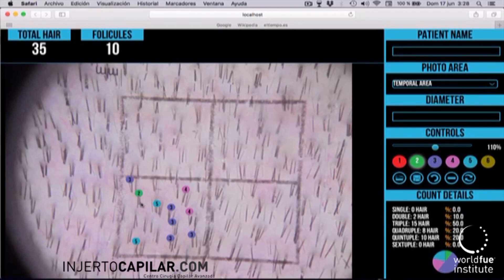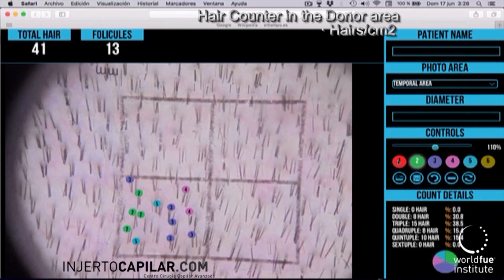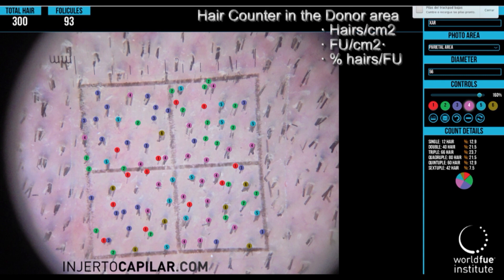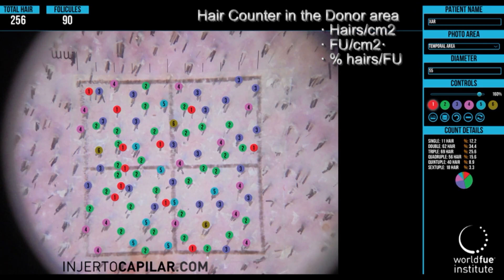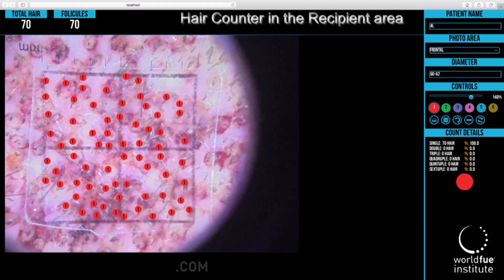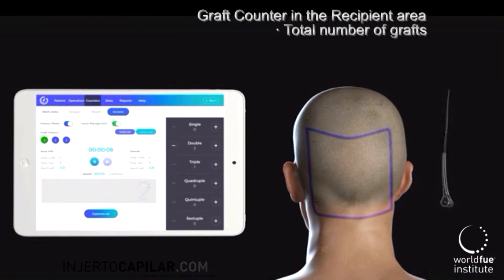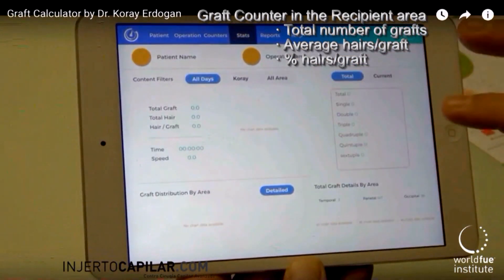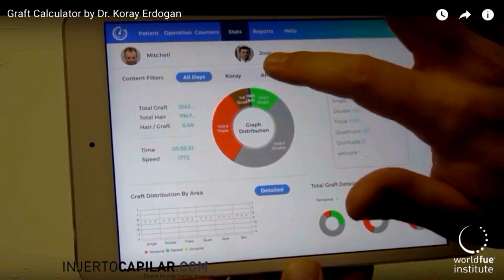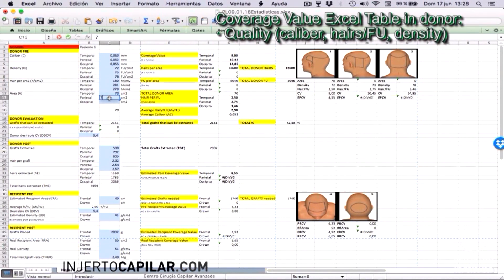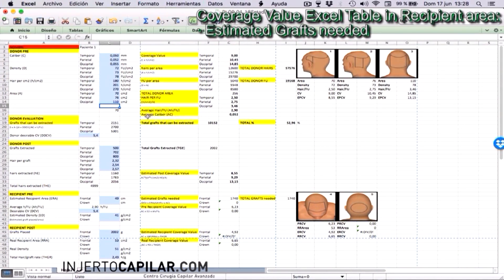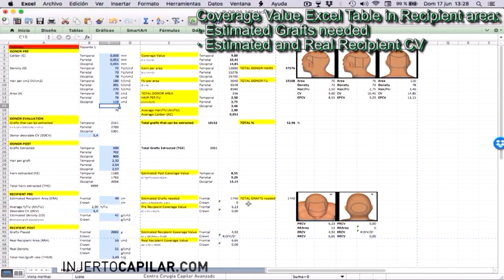The hair counter is an application that gives us pre-op information about hairs and follicular units per square centimeter and percentage of singles, twos, threes, and so on per square centimeter in random samples taken from the temporal, parietal, and occipital areas. The graft counter is an application that informs us about the total number of grafts extracted, the average hairs per graft, and the breakdown of singles, twos, threes, and so on. The coverage value Excel table gives us broad numerical information about the quality of the donor area in the pre-op, the estimated management of the donor area after extraction, the density and number of grafts estimated to cover a given recipient area, and the final coverage value of that recipient area after the placement of the grafts.